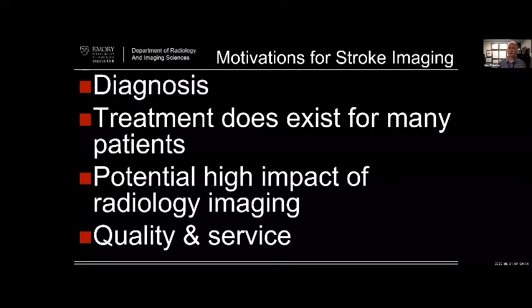Over the course of time, I've seen the imaging be more and more important. When I did internship, I remember that the focus was on doing a non-contrast head CT in the ER and seeing if the patient had hemorrhage or an alternative diagnosis like a brain tumor, for example. And then doing another head CT maybe 3 days later to show that it was actually an infarct. And at that time, thrombolysis was pretty rare in my experience. And utilization of MRI, even though it was around for diagnosis, was rare as well. CTA kind of made its way into common practice, I would say, when I was a fellow.